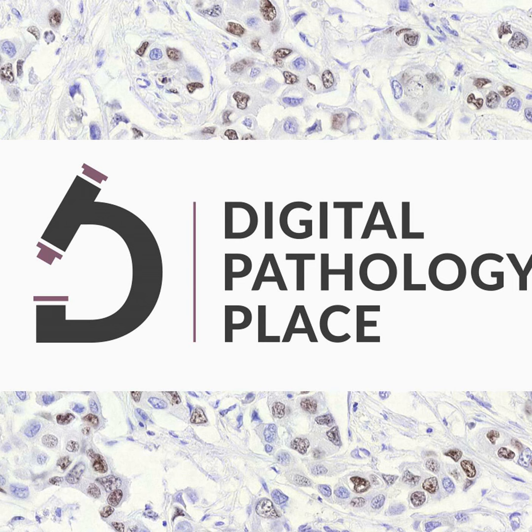C. Data management and high-throughput analysis. The advent of digital pathology has resulted in the generation of large amounts of digital image data that require effective management and analysis. We are far beyond the point of putting all the image files in folders manually. This would lead to an organizational disaster. Data management in digital pathology includes storing, retrieving, and organizing digital pathology images and associated metadata. This necessitates the use of robust data management systems capable of handling large and complex datasets, ensuring data integrity, and providing user-friendly interfaces for data access and navigation.